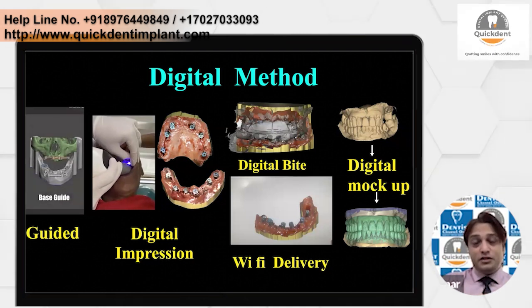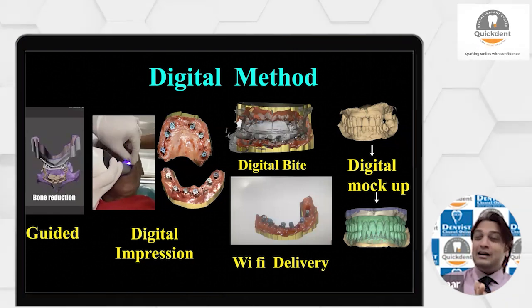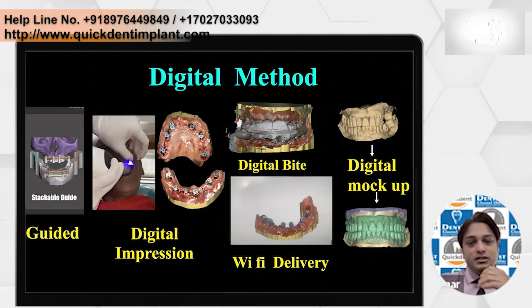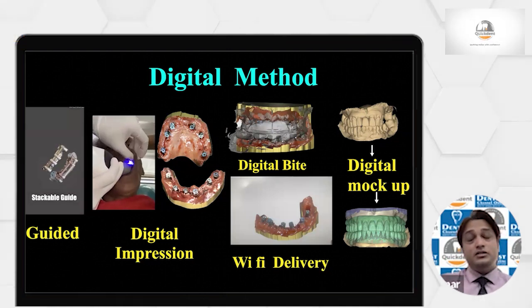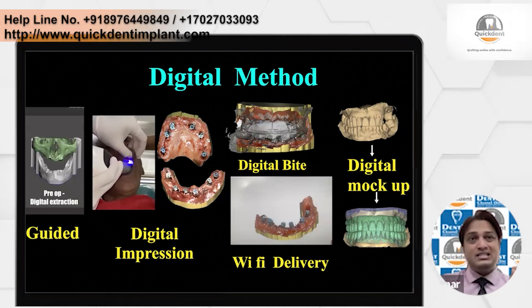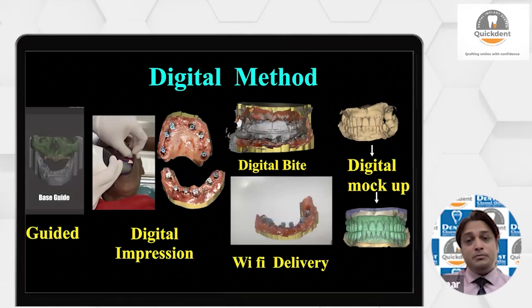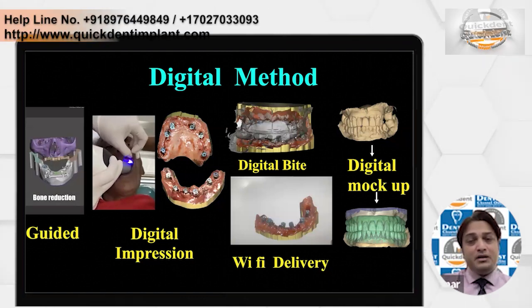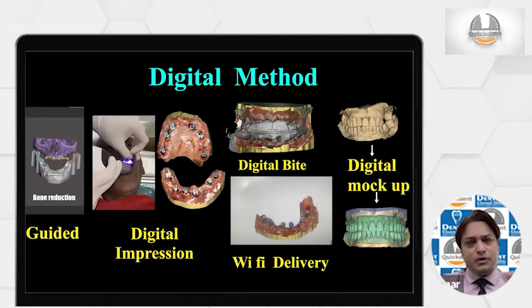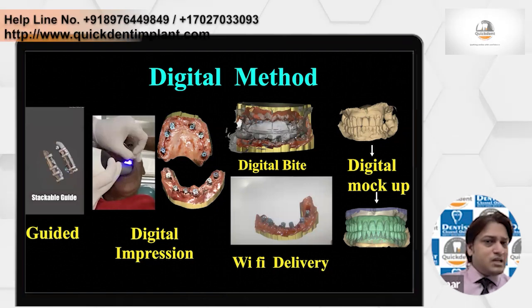And of course the accuracy of digital scanners has improved a lot, but definitely it is not 100% accurate. So you need to do a jig verification even if you are using a digital scanner, a digital bite or digital impression. The jig verification is the most important aspect, because it is not just the scanning, it is also the printing, which can create an error. For example, some printers may print with a little shrinkage, and some print so that instead of shrinkage it loosens. So things can go wrong.